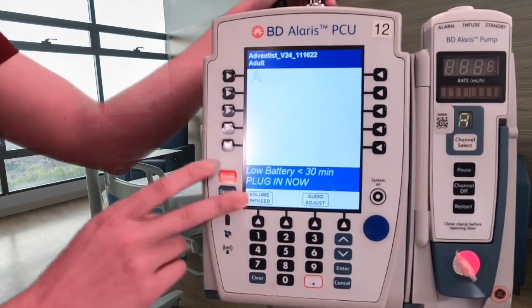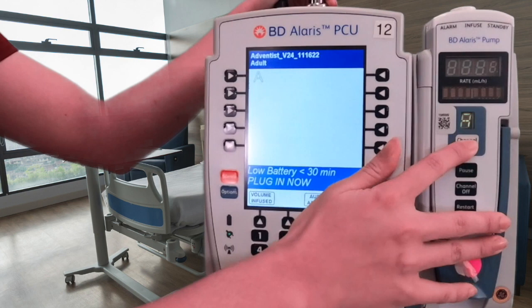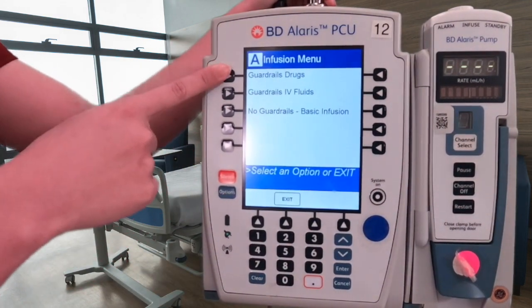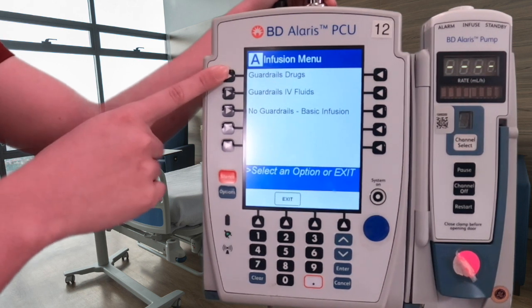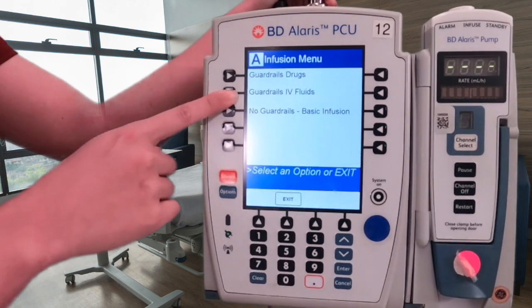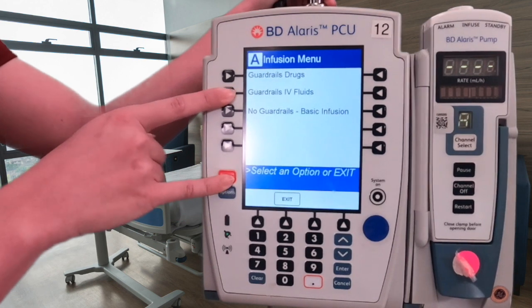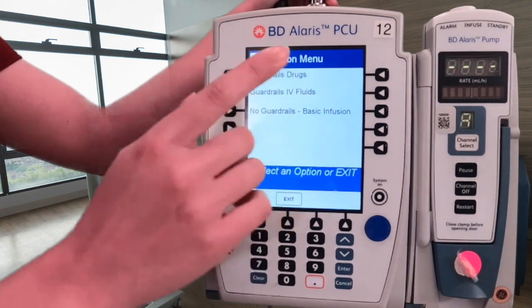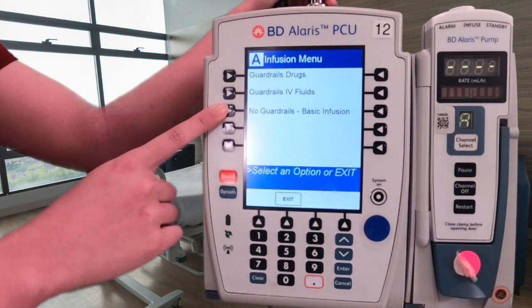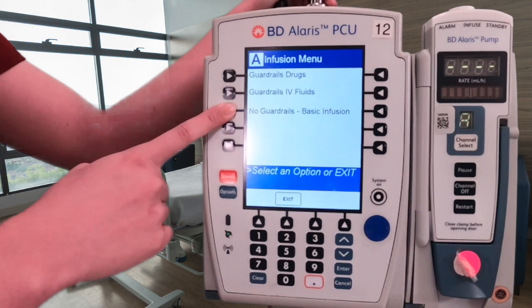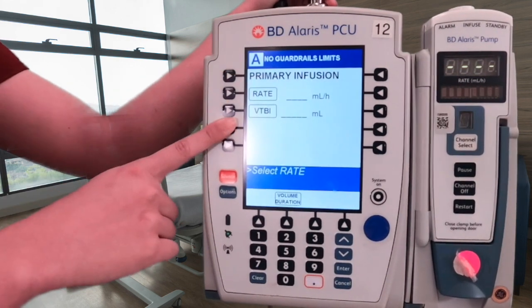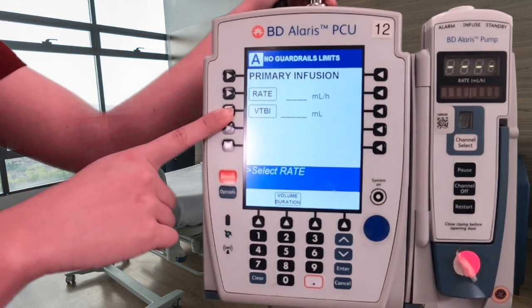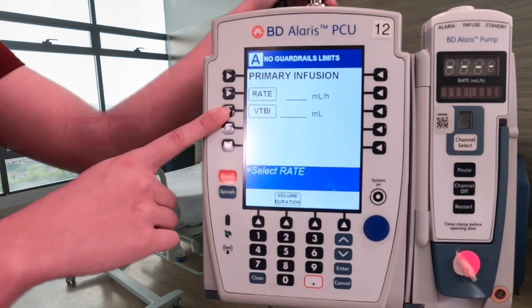To go back, press exit, then channel select again. Guardrail Drugs is for administering medications and secondary fluids such as antibiotics. The second option, Guardrails IV Fluids, is for IV fluids such as a fluid bolus. Last but not least is No Guardrails — we never use this one, or try not to, because when you press it there are no safety features. It goes straight to rate and volume to be infused without knowing what exactly you are administering.